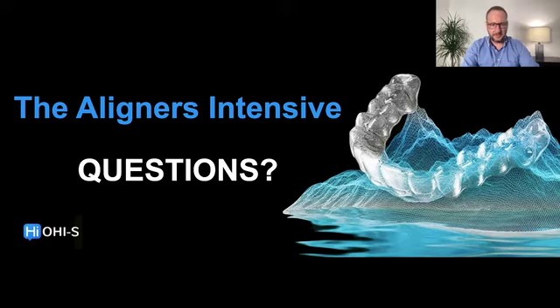And just complementing this, I don't have any other question for now. My diagnosis is going to be based on the position of the upper incisor. Okay, when I understand that the ideal position of the upper incisor is in this position, according to the face, the anteroposterior, the vertical, this is going to define the position of the whole upper arch. Okay, and then after that, I will understand the diagnosis.